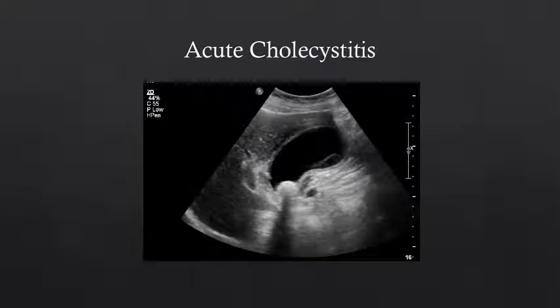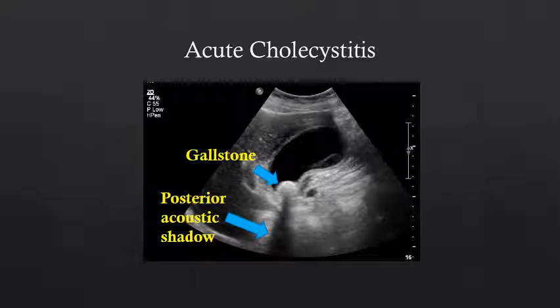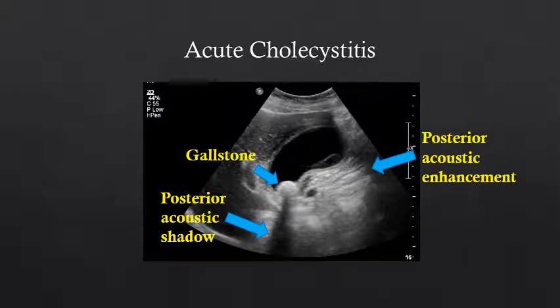Now let's look at a patient with an abnormal gallbladder. This person has acute cholecystitis. We see the gallbladder as a hypoechoic fluid-filled structure, but in the neck of the gallbladder, we can identify a gallstone. The gallstone appears hyperechoic because it is a very effective reflector, and there is a sharp interface between the fluid within the gallbladder and the gallstone. Deep to the gallstone, we have posterior acoustic shadowing because the sound waves cannot pass beyond the gallstone. Along the fluid-filled portion of the gallbladder, we can see posterior acoustic enhancement, as sound waves pass relatively unimpeded through the fluid, making structures deep to the fluid brighter than the adjacent soft tissue.